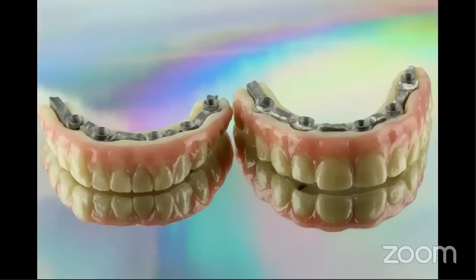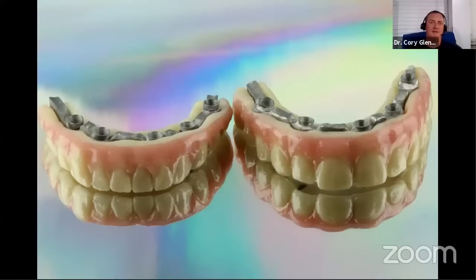With your Form 3B, have you had any problems with adherence to the build plate if trying to print a single crown or a similar small object? I have not run into it. I've done a lot of single crowns on there. And thus far, it's not been an issue. They tend to pop off.